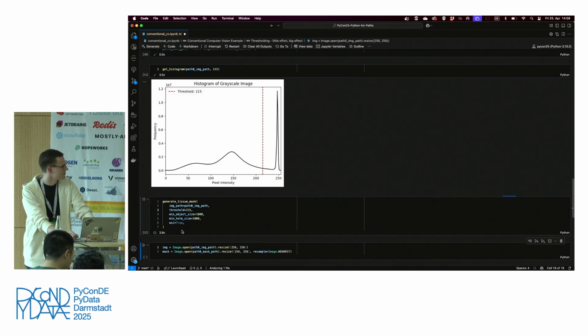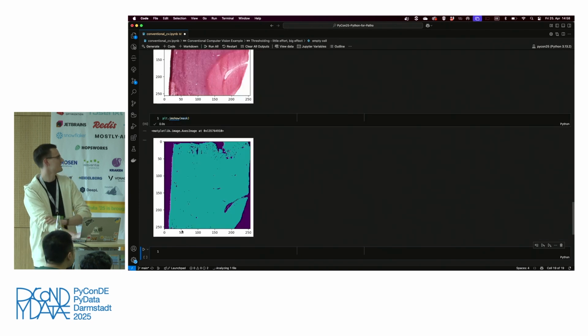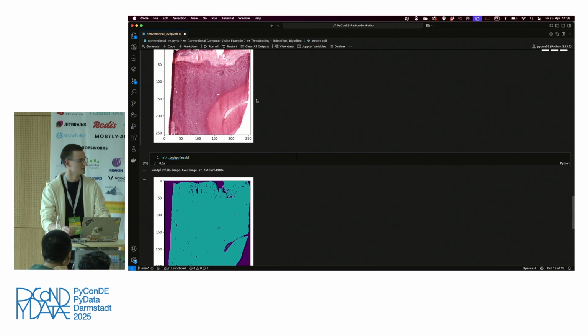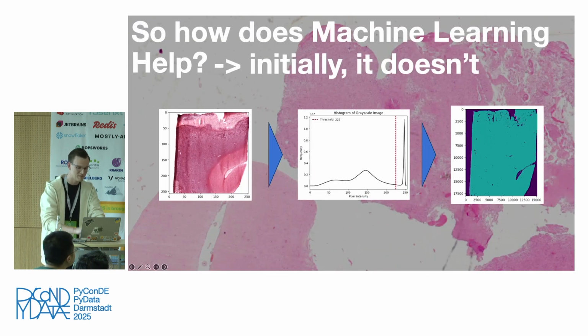And while I talk about way longer, I have to admit I just used NumPy arrays, as you have seen, without any optimization. So this is the most simple approach you can do, and it took me not even 7 seconds to generate the whole tissue mask for my image. This part takes by far the longest, and we are done with a nice tissue mask for our whole slide image in not even 10 seconds total processing time without touching machine learning. Just as a little reminder to maybe sometimes choose the simple path instead of the hard one.